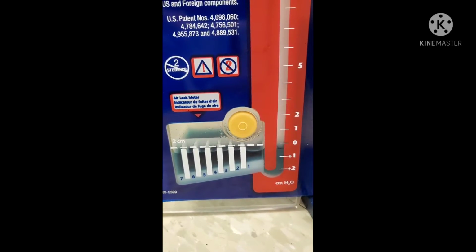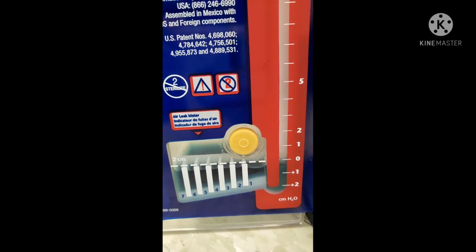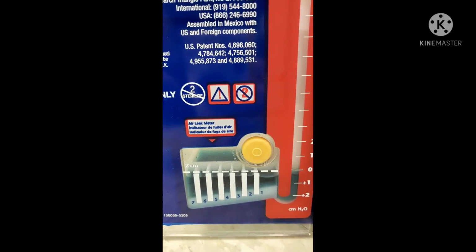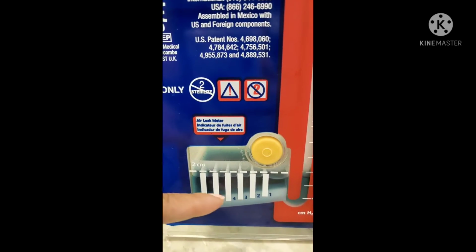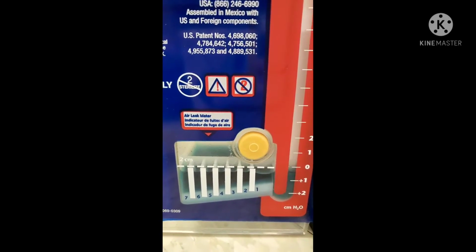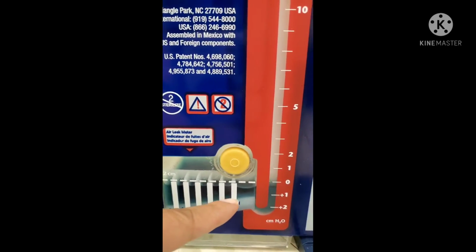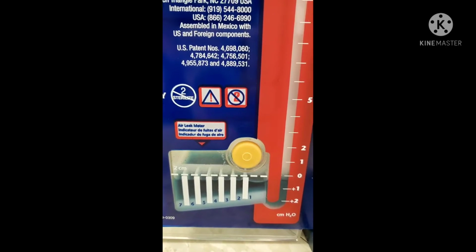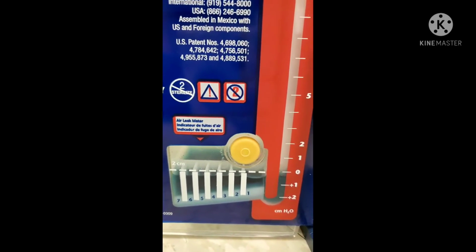All right, let's look at the next compartment. Remembering that this is a dry suction chamber, notice that we still have a water seal, and the water seal is what's going to tell us if my patient has an air leak. You see that they have different numbers here. The grade of air leak will depend on how much bubbling I see.